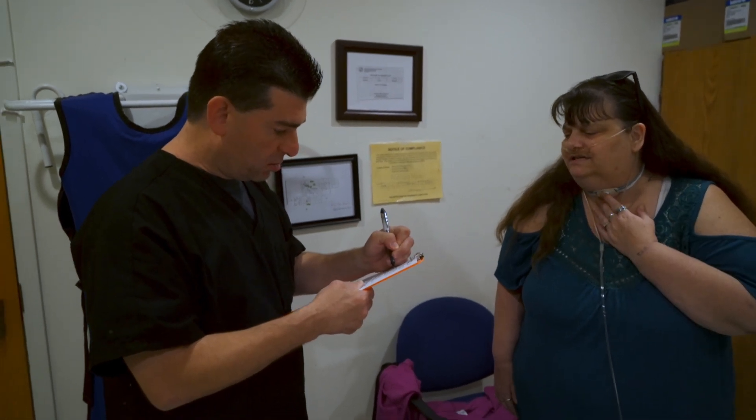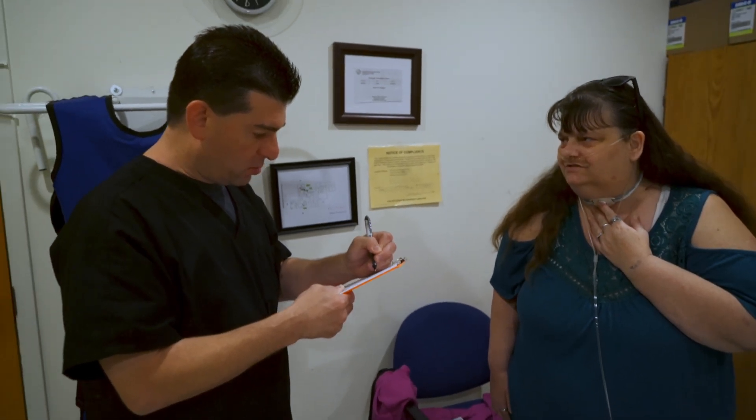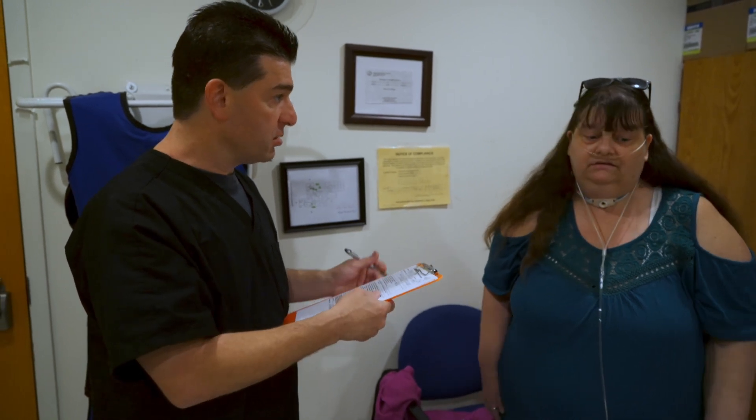Any chest pains? We're doing a CT on your chest. No chest pains? I thought you were doing a CT on my head for cancer — that's what the doctor said. He said I had lazy eye, he wanted to check for cancer. Well, maybe he's doing a different test with that, but right now he wants to do a CT on your chest. OK?